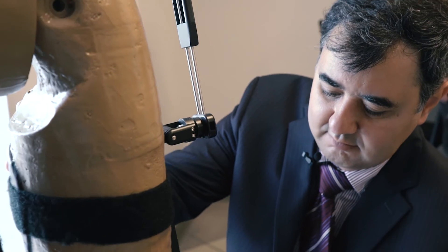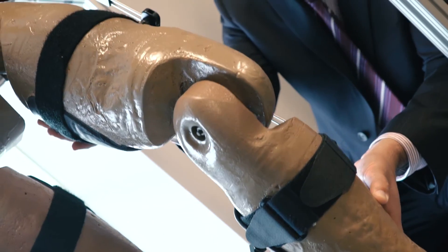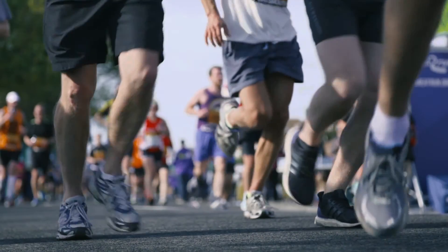The exoskeleton that we designed contains a hip joint, knee joint, and ankle joints. What we try to do in the lower limb exoskeleton we designed is to produce the same functionality as natural human joints.